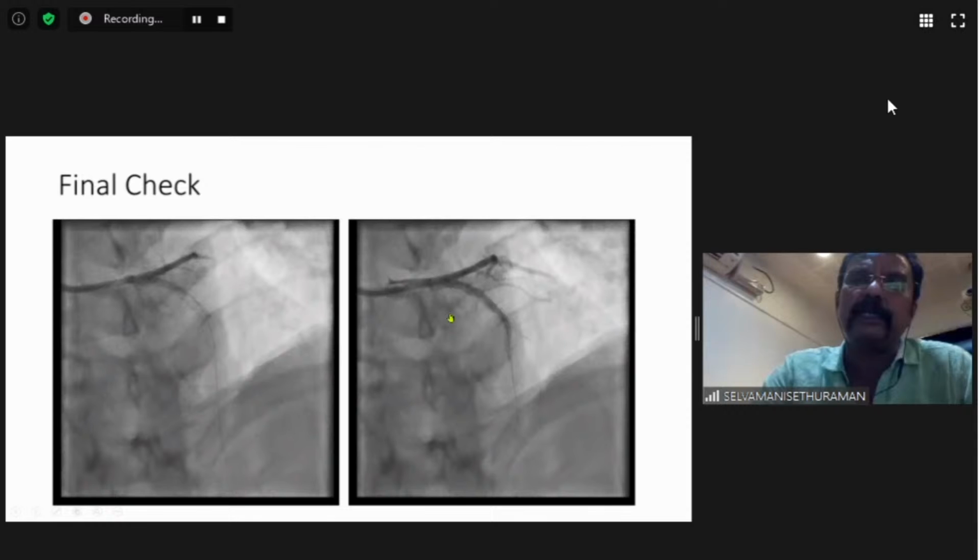Then you take so many decisions, where some people land up putting one more stent, producing proximal dissections, all those occur. But when you have imaging, when you know the definite reason for stent thrombosis, you just treat it, and you come out with good results without many complications.